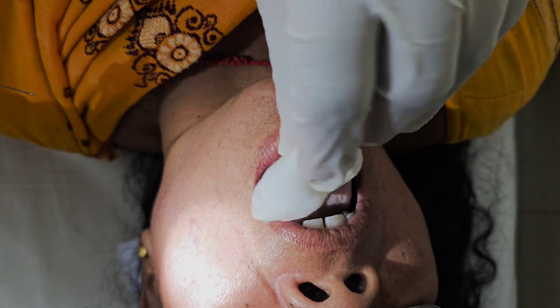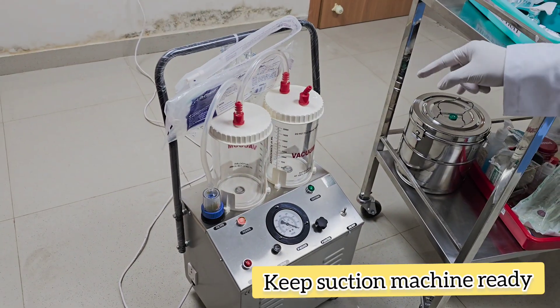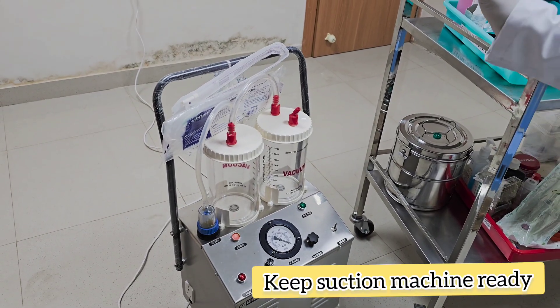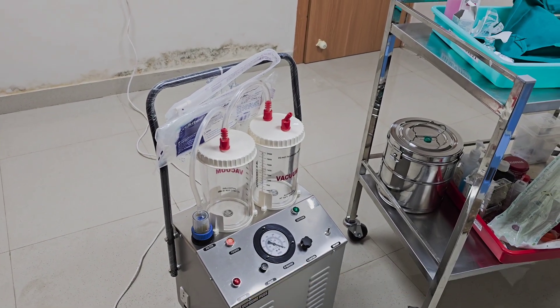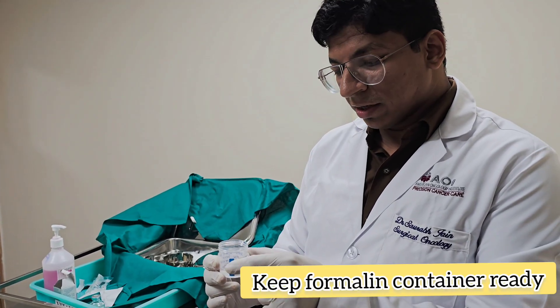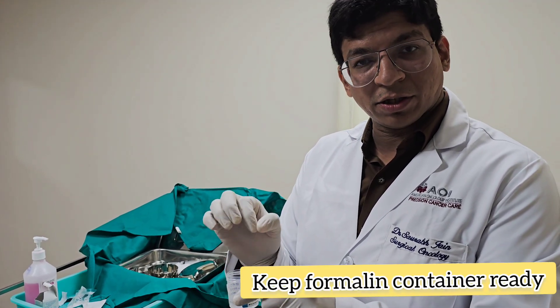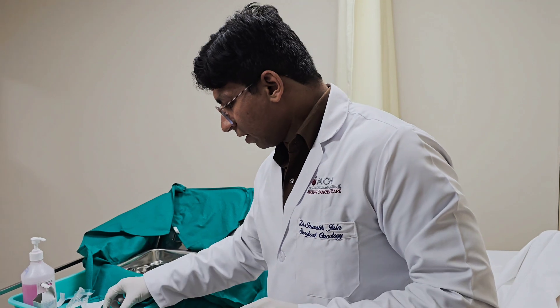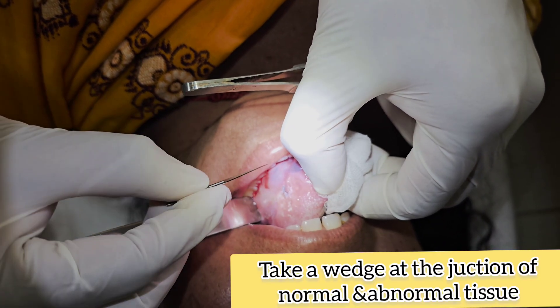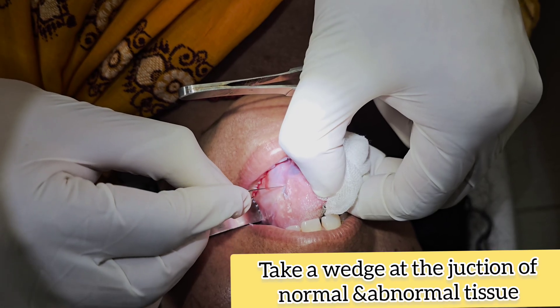We have a suction machine ready in case there is bleeding, to aspirate the blood. We are also keeping a formalin container ready — we'll be placing all the tissue inside it. From the edge of the ulcer we'll be taking a small tissue sample.